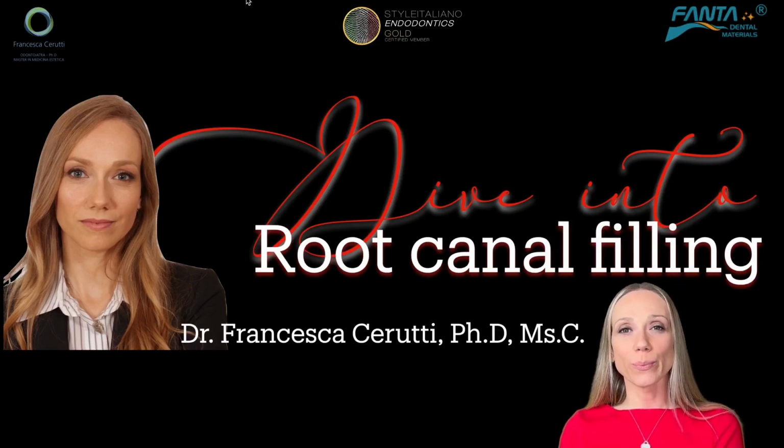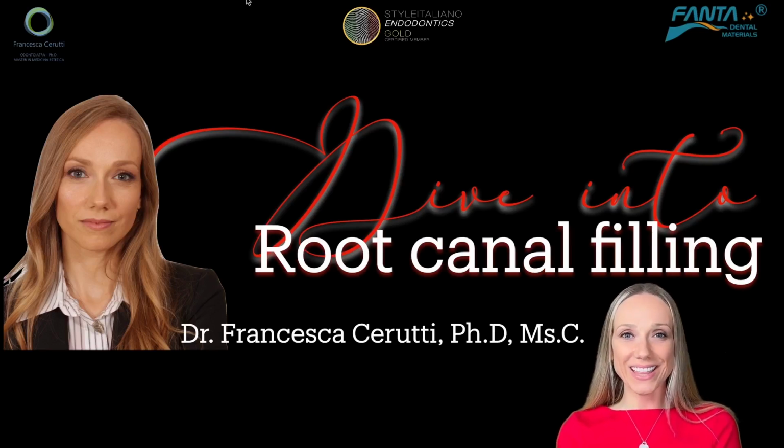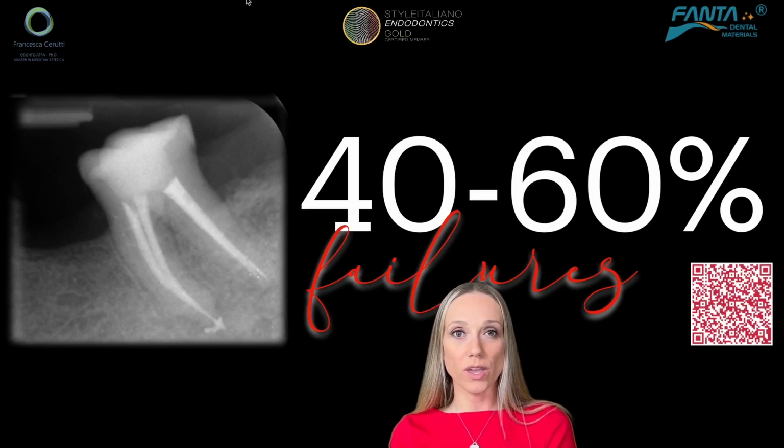Today my topic will be root canal filling, and I would like you to dive into root canal filling in order to completely understand the importance of this passage for the outcome of root canal therapy. Why do I say so? Because a recent review by Chiara Pirani and Josette Camilleri stated that 40 to 60% of failures of endodontic therapy is due to the quality of the root canal obturation. And so, if the obturation is non-satisfactory, we are extremely likely to have a failure.